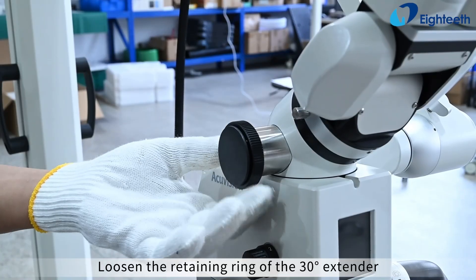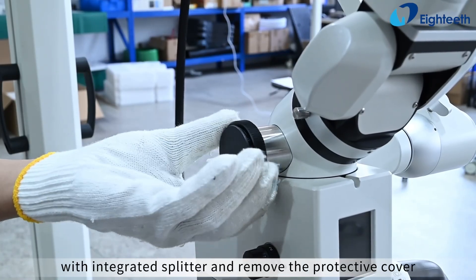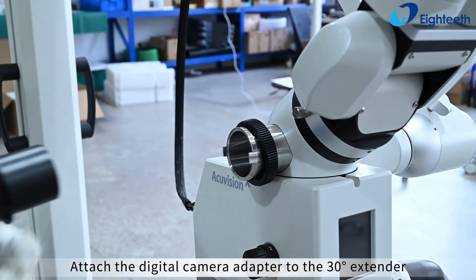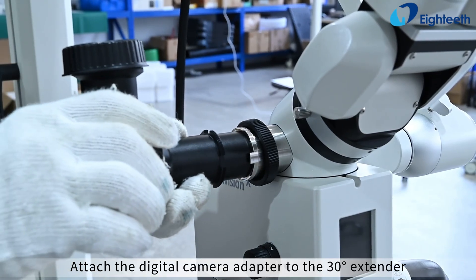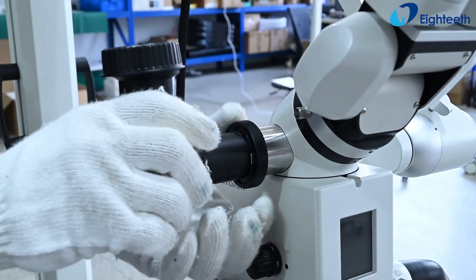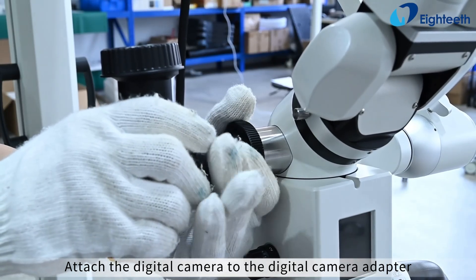Loosen the retaining ring of the 30-degree extender with integrated splitter and remove the protective cover. Attach the digital camera adapter to the 30-degree extender with integrated splitter and tighten the retaining ring. Then attach the digital camera to the digital camera adapter.